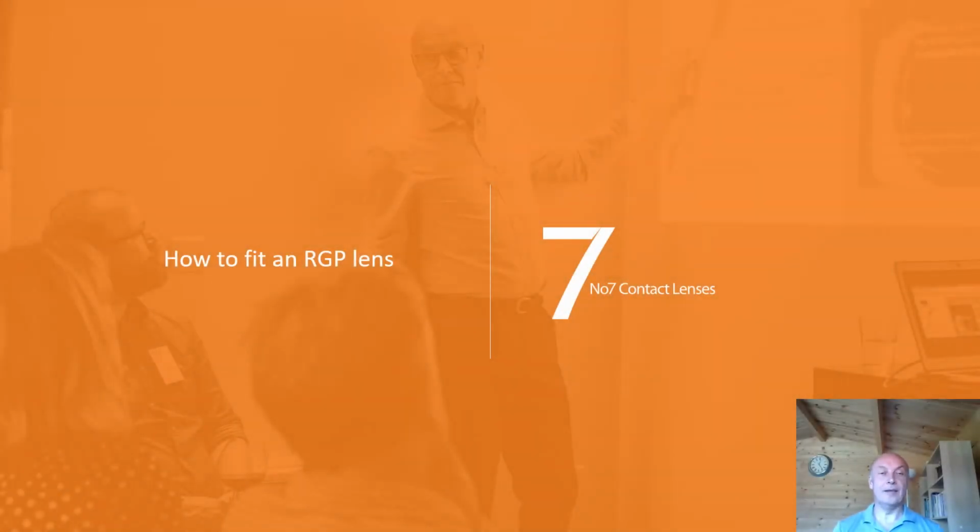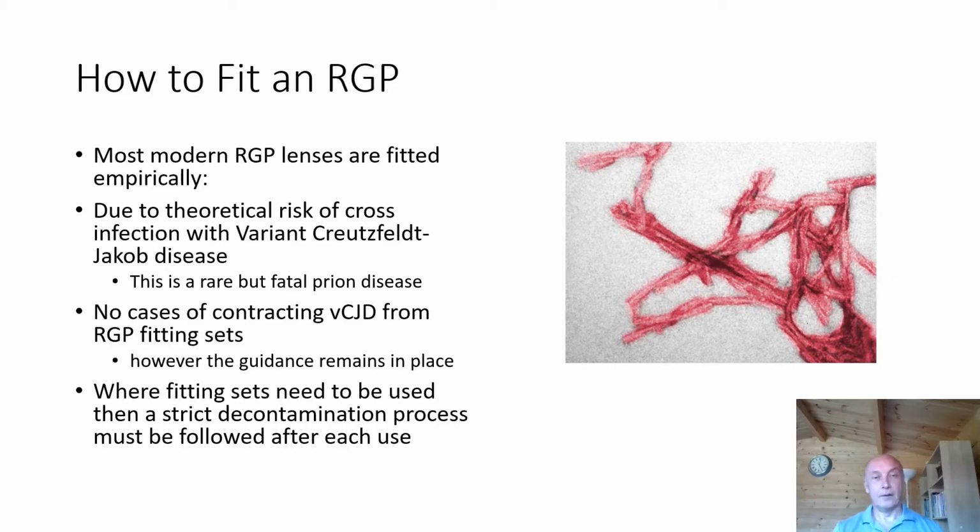Hello. In this section we'll consider how to actually fit a gas permeable contact lens. What's the process, what's involved, and what do we as practitioners need to do? How to fit an RGP? We mainly fit them empirically now.